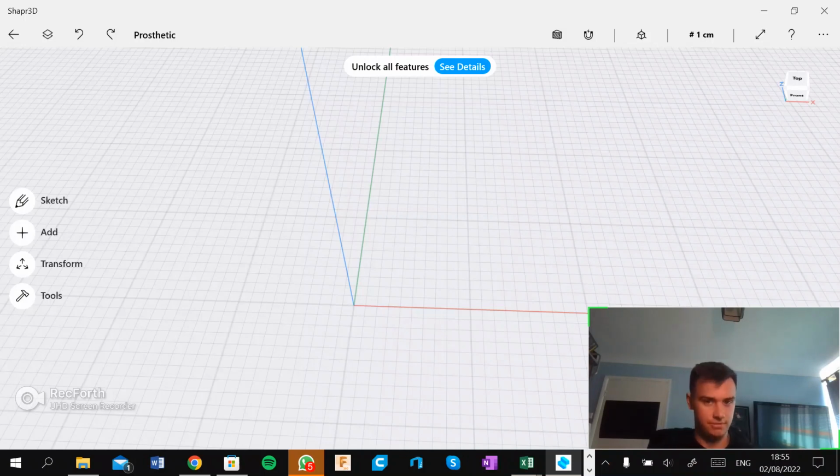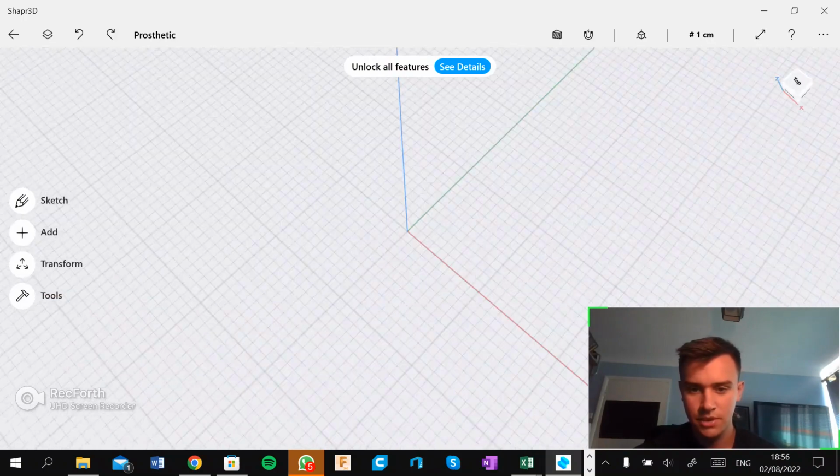my own. Just as a base standard, I have 4 fingers and a thumb, but I decided to just go with 3 this time, just to see how it goes, and it also means that when it comes to motorization, it will be a bit easier to do for my first one. And so let's see what we got.